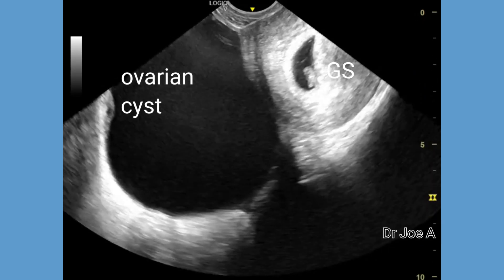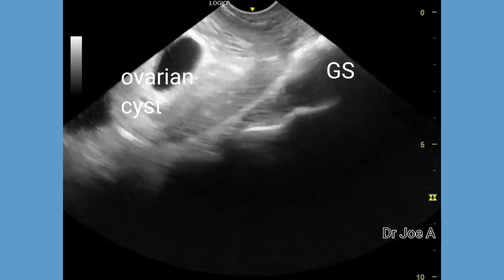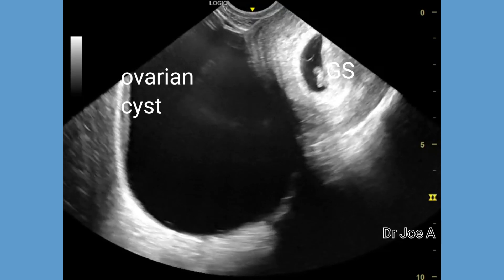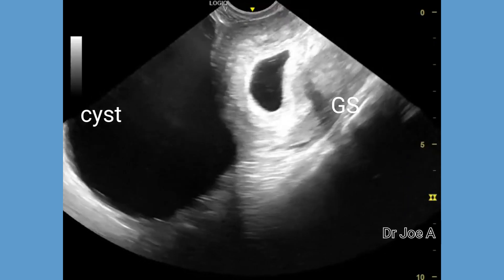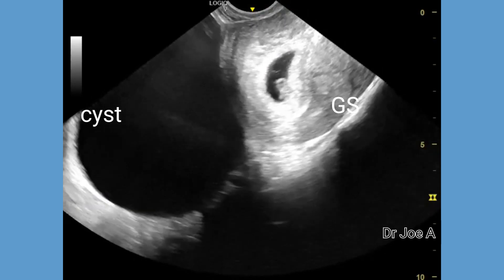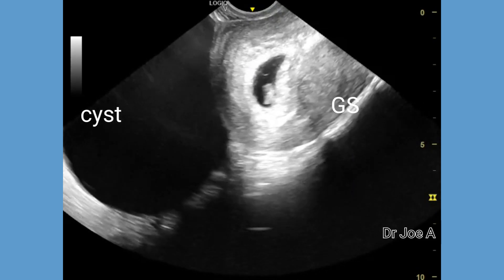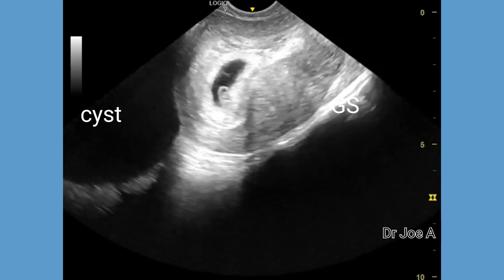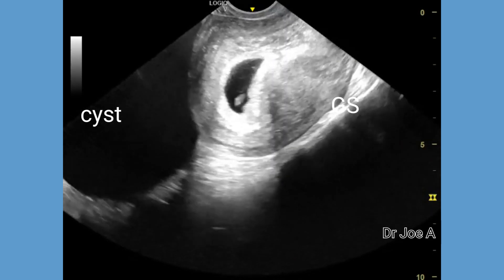We concluded that this patient does not have any other significant findings besides the ovarian cyst, and hence a final diagnosis of a large maternal ovarian cyst with fibrin strands within the gestational sac was made. We swept through the ovarian cyst as well as the gestational sac, and the prognosis in this patient appears to be good. The maternal ovarian cyst needs to be regularly followed up, while the fibrin strands may not be of much significance.